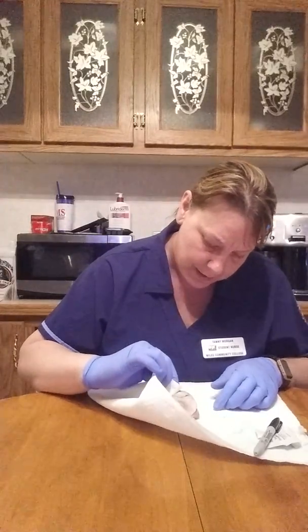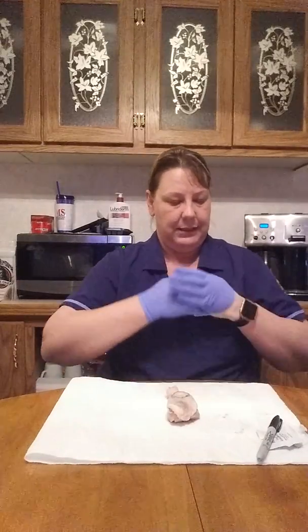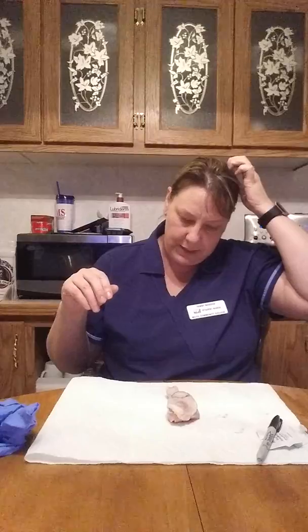And if there's any blood there, I'm going to just dab it a little, not much, and then go ahead and let the patient be on their way. I'm going to go ahead and take off my gloves and wash my hands, and then once I'm done and I've explained everything to the patient, I'm going to go ahead and document what the medication was that I gave, the route that I gave it, the amount that I gave, the time that I gave it. So that is my intradermal injection demonstration.